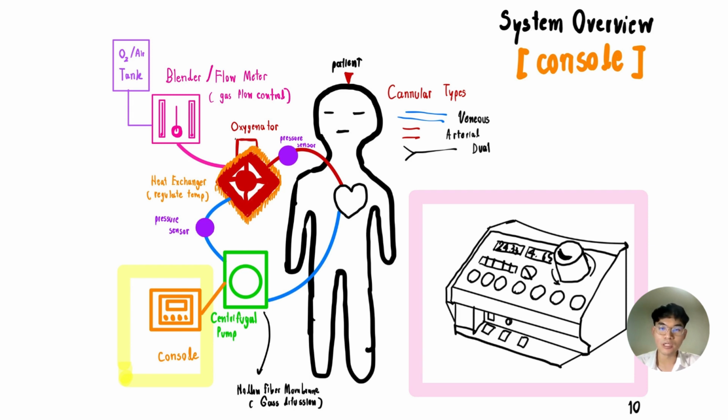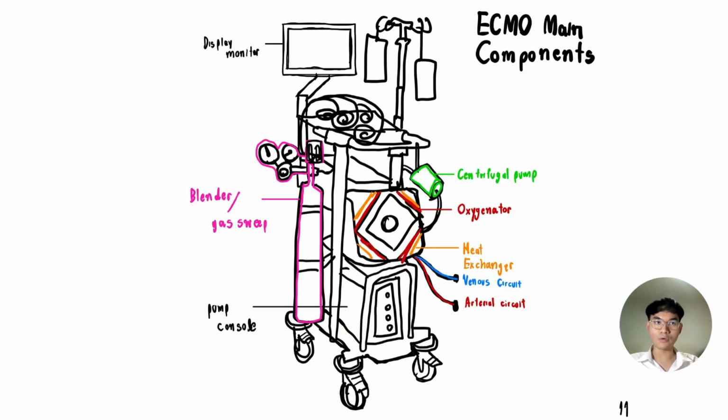And this is all about the major components of ECMO. And this is the visualization of how each component is attached together to make the ECMO system complete.